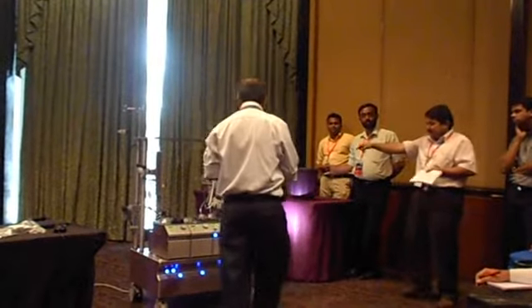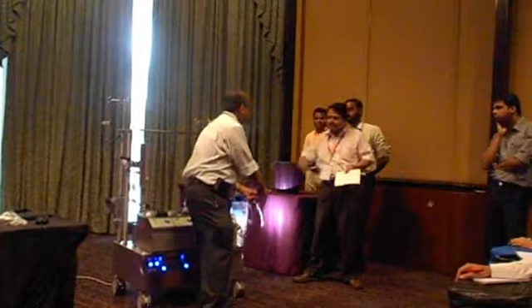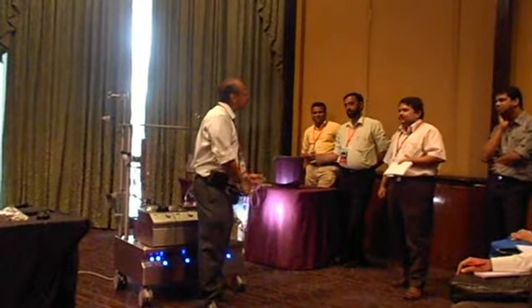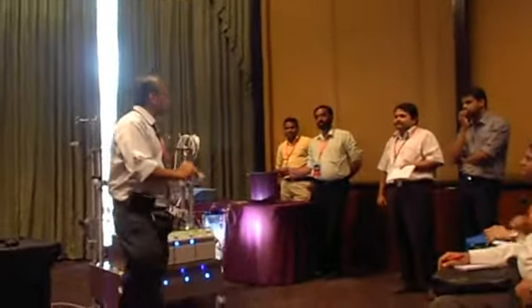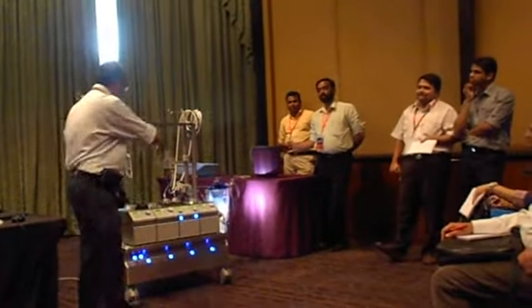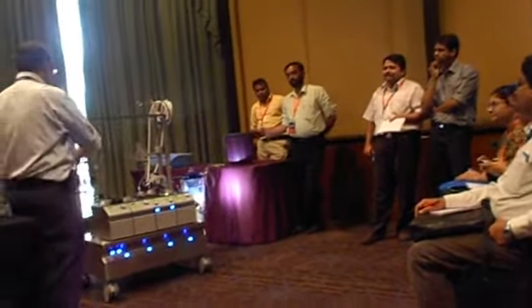I will ask the perfusionist to put it here and here. What is the pressure required to run a membrane oxygenator? 65 pascals. PSI. 65 PSI. You think your ambu you are going to do 65 PSI? Oh, you want me to sit here and push?